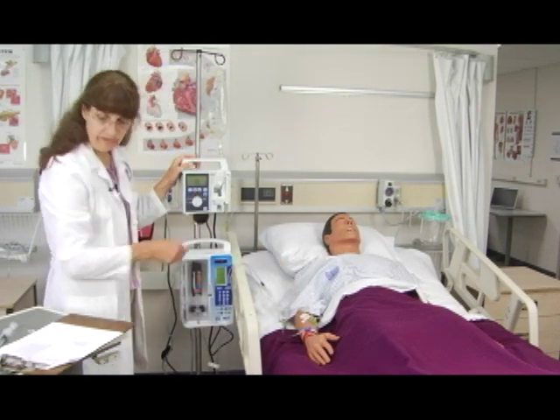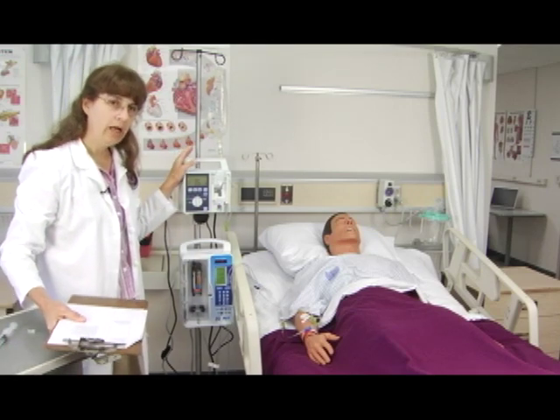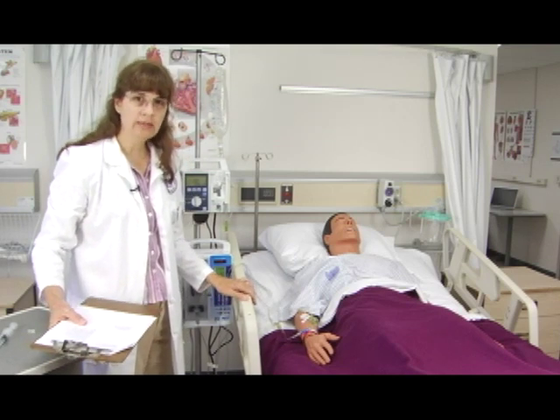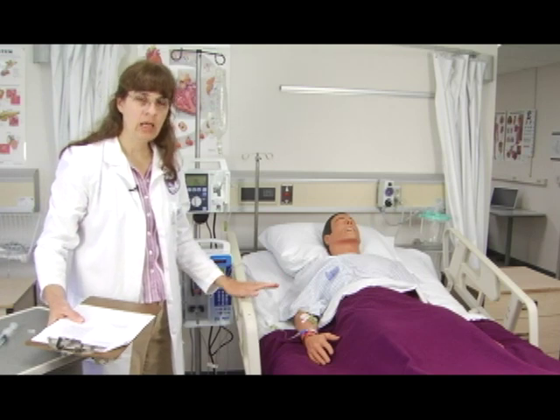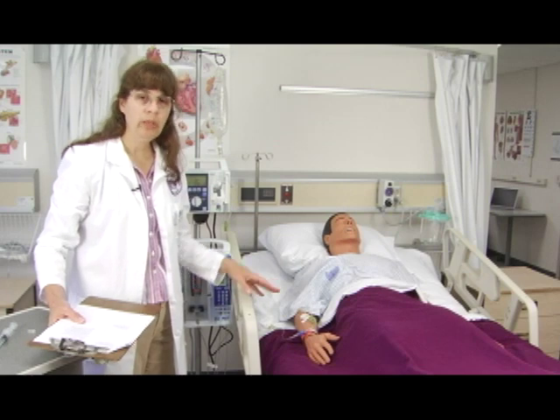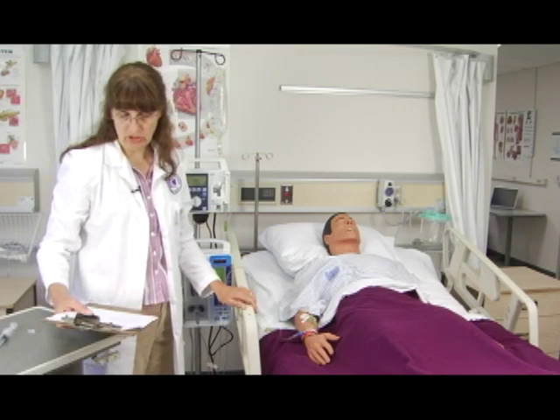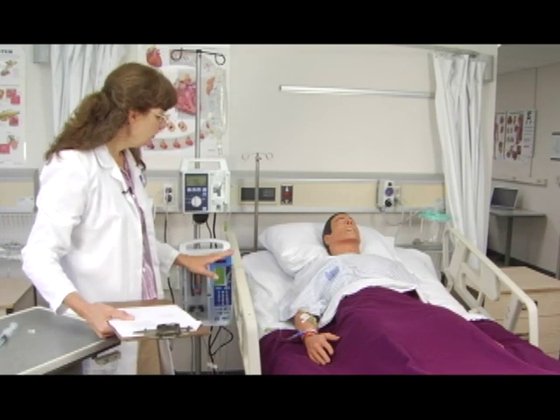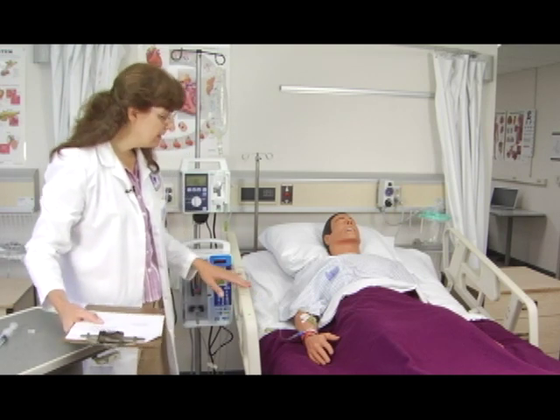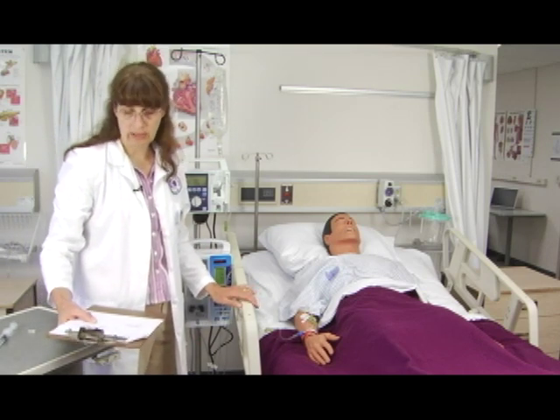Next, we'll connect our tubing. We'll turn our IV to run. If the patient already had an IV fluid infusing, we could have used that as a flush for our PCA line — it's just a matter of connecting it in the room and flushing that short piece of tubing, getting the air out of it before you connect it to the patient. Once you've connected it to the patient, you want to make sure that all your clamps are open. And if your PCA has a continuous mode, you want to press start to begin that infusion.